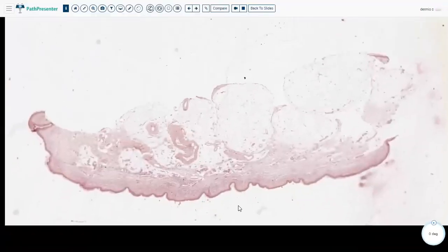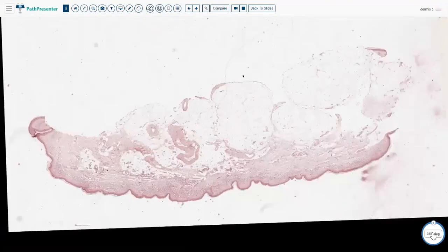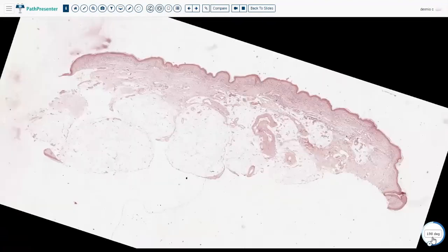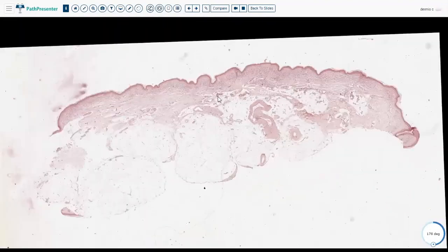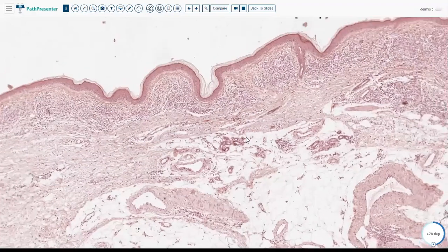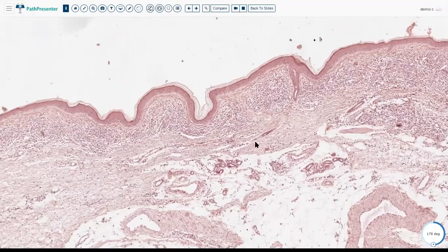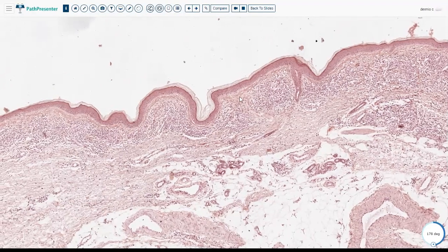Moving on to the opposite — a decrease in dermis. This is a case of chronic Lyme disease, where they get acral thinning. You can see very thin collagen compared to what we saw earlier.